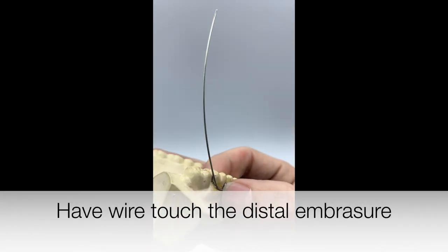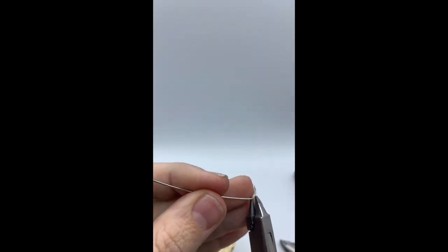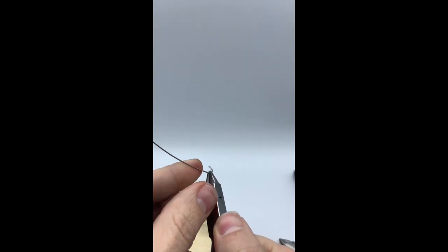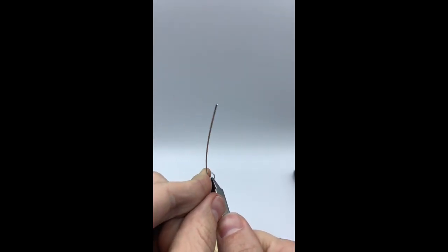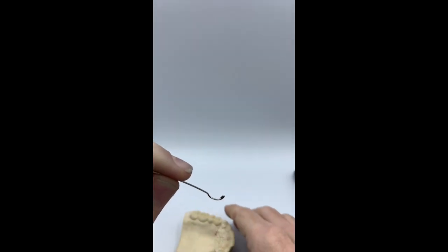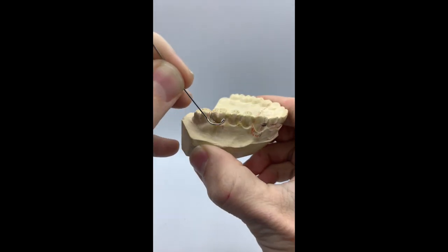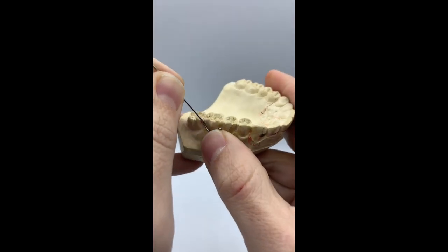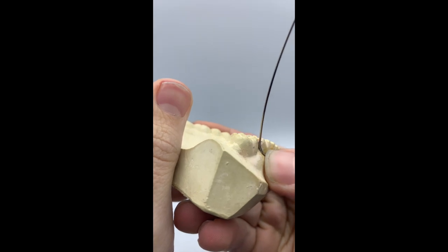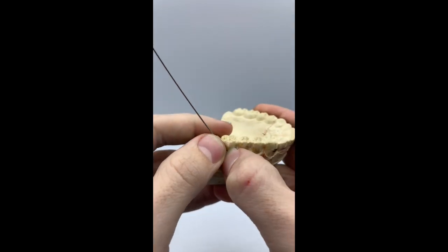Once the wire is contacting the buccal surface, we want to get the wire tucked into that distal embrasure. To do this, mark where your wire needs to be bent, hold the wire straight, and bend the longer end towards the outside. As you see, the wire is now inside that distal embrasure.